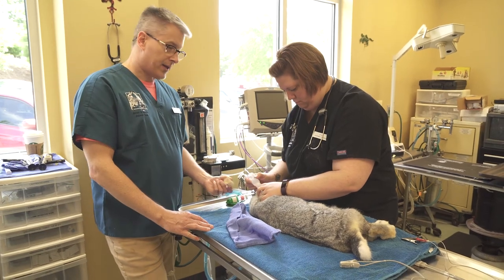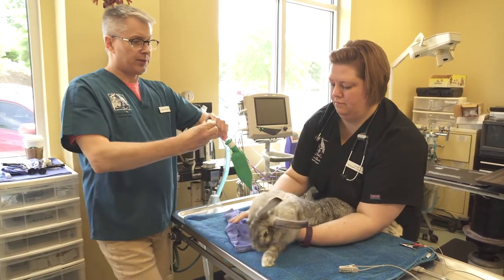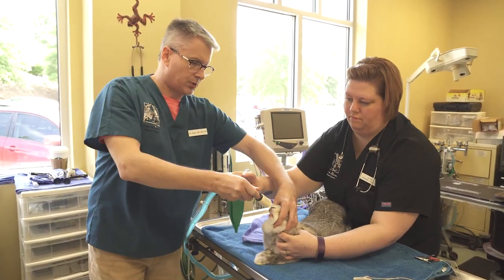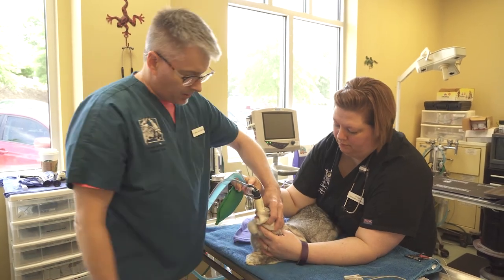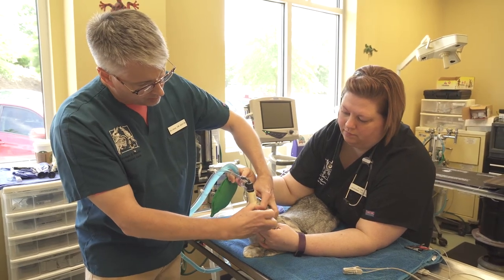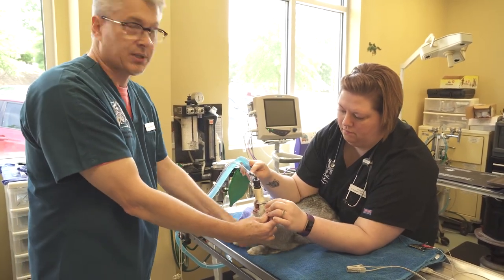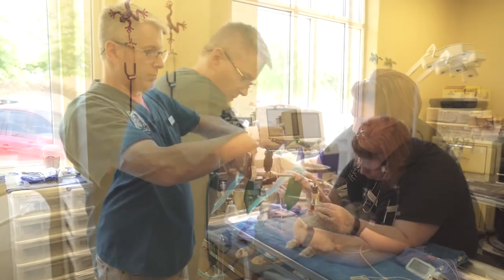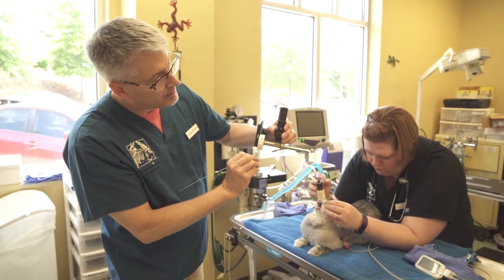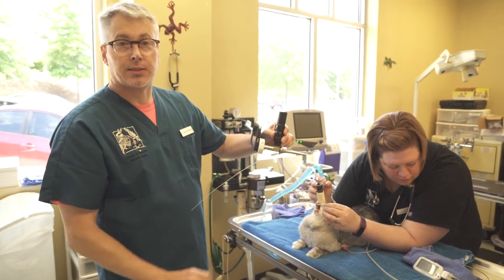Once we have her sternal in the position we want, we're going to switch from a face mask over to a ¾ inch C-PVC coupling from the hardware store, and we will make a nasal mask with that. For some procedures I also use a rodent rabbit mouth gag, which we engage on the incisors. Once that is engaged, your assistant holds that instead of holding the rabbit's mouth. We set up the scope upside down, which allows us to present the catheter guide towards the widest part of a rabbit's glottis, which is ventral.